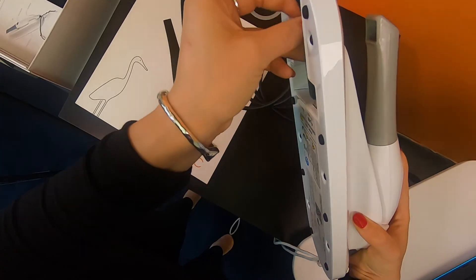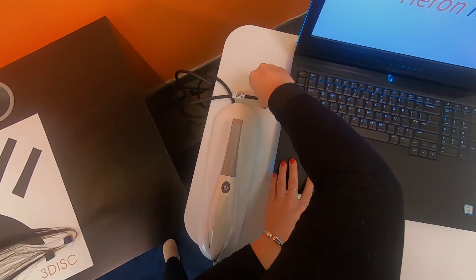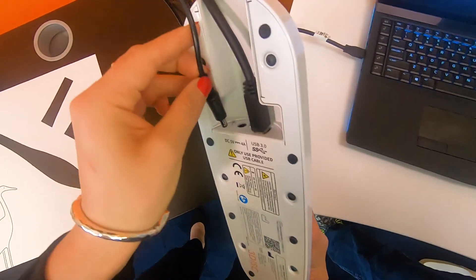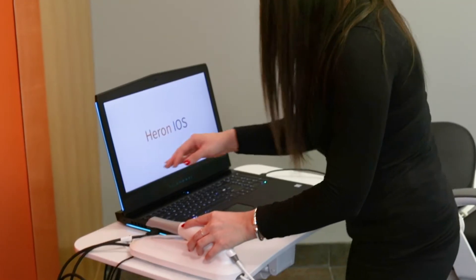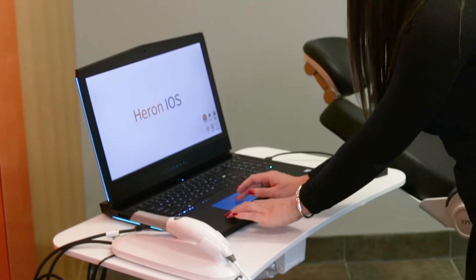To begin the installation, plug both USB dongles into your laptop. Plug the USB cord into the back of the Hair on and also into your laptop. Plug the AC adapter into the wall and into the back of the Hair on. Place your Hair on on a flat table or surface — you are now all set and ready to scan.